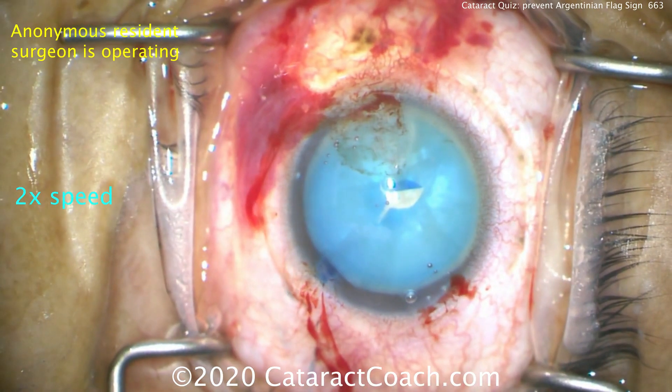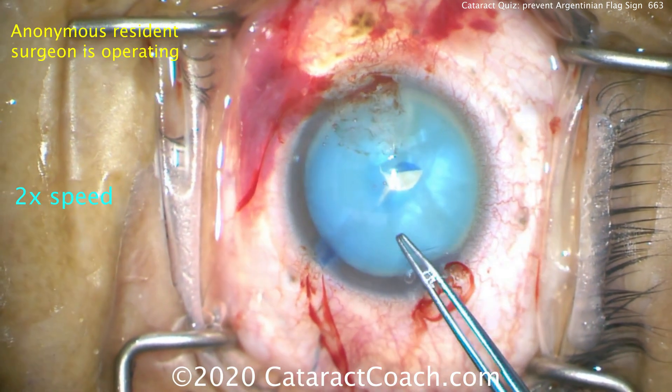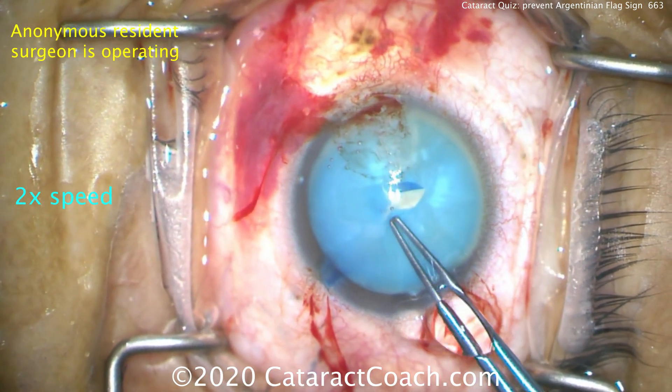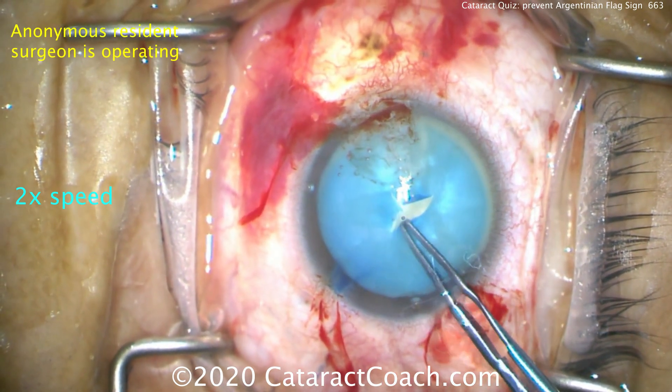The incision is going to be made here — that looks like a pretty good incision. Now the forceps are going to be used to create our rhexis. Be efficient here. Don't waste time. The longer you're in the eye, the more likely it's going to run out.